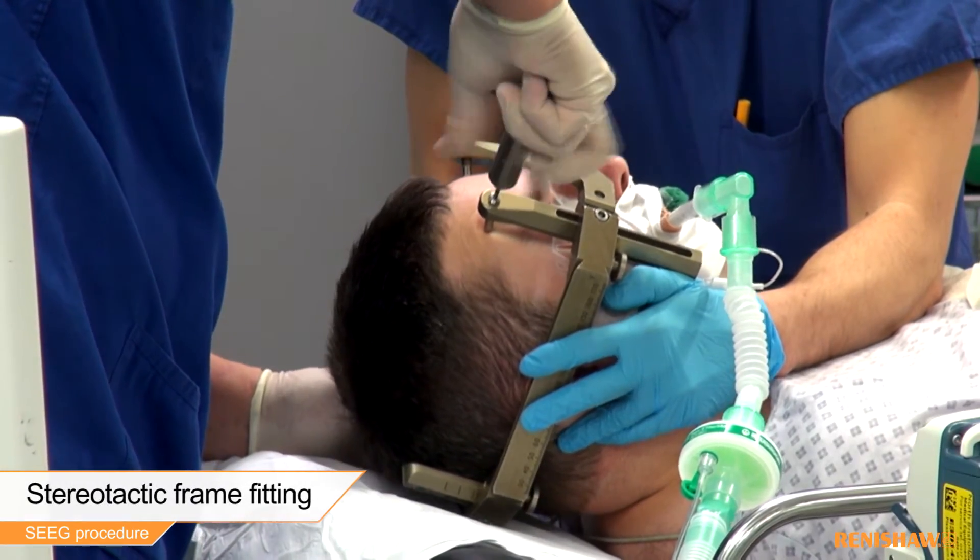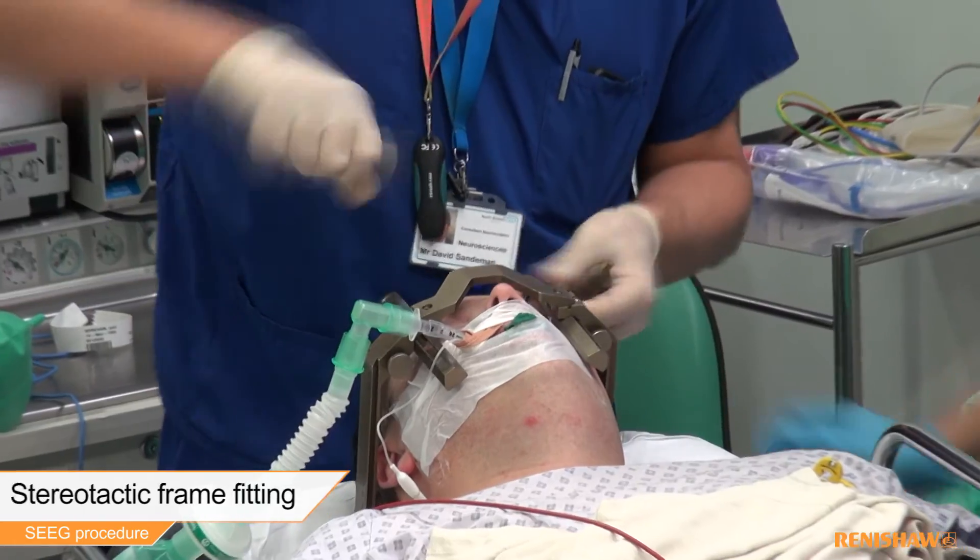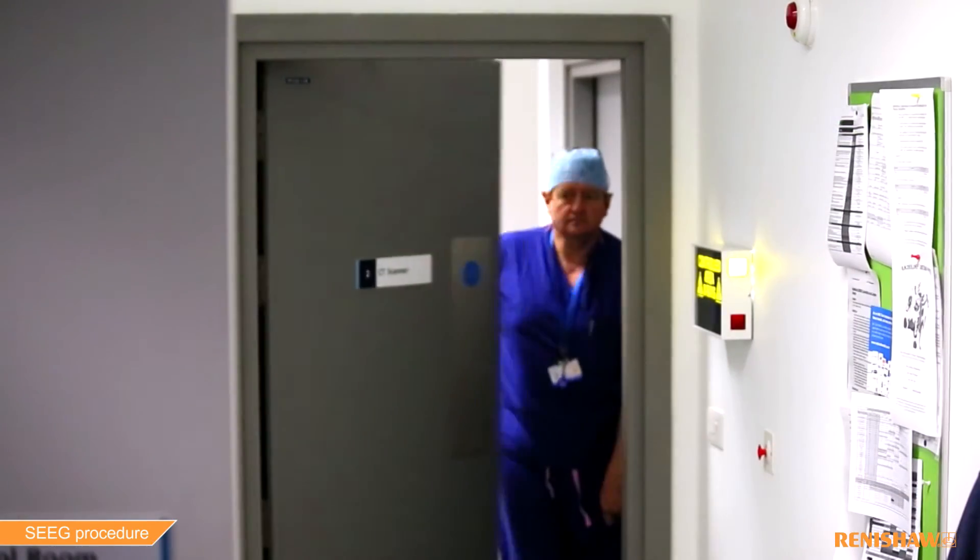Following general anaesthesia, the patient is fixed to the Neuromate robot and, in this example, the base of a stereotactic frame is used.